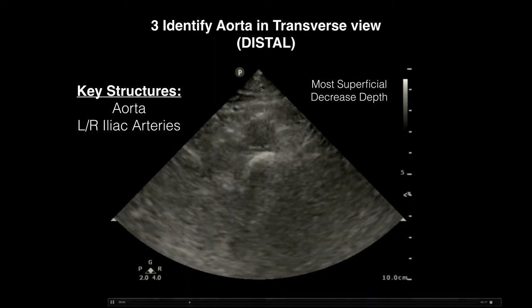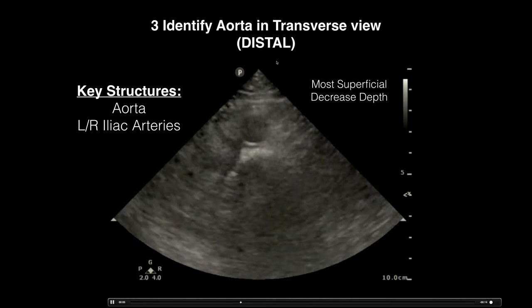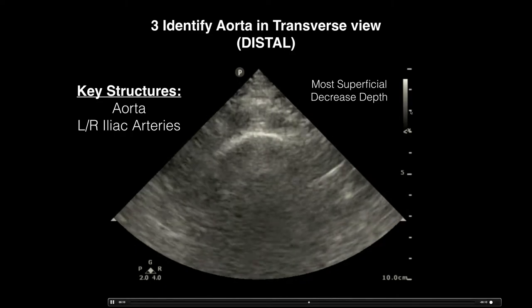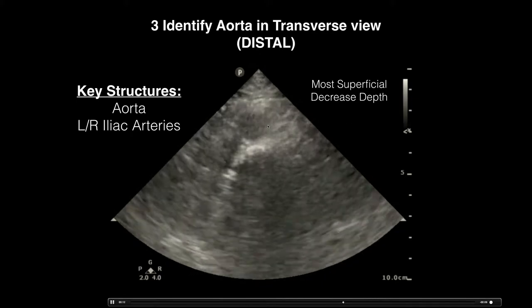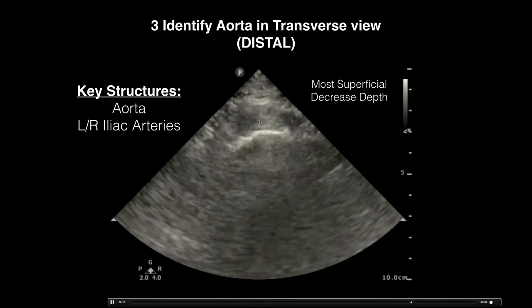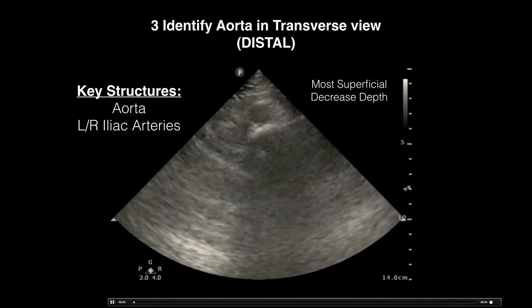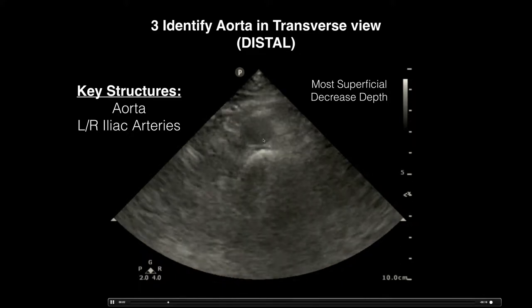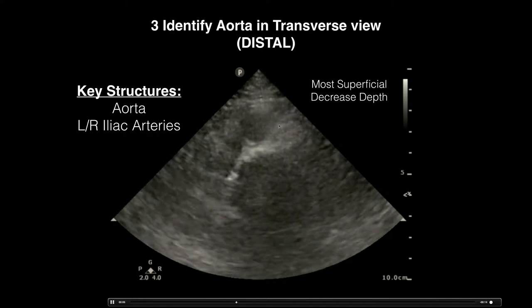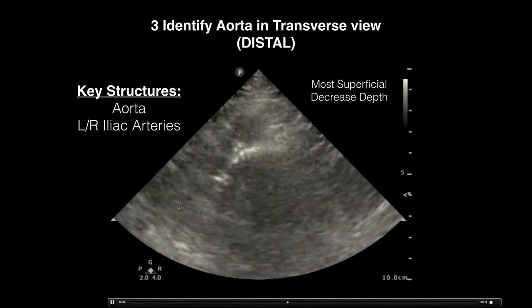The third view is the transverse view of the distal aorta, which is very superficial — only about two to three centimeters deep. Once you have scanned this area, you can actually see the aorta bifurcate into the right and left iliac arteries. Make sure that the iliac arteries are less than 1.5 centimeters.